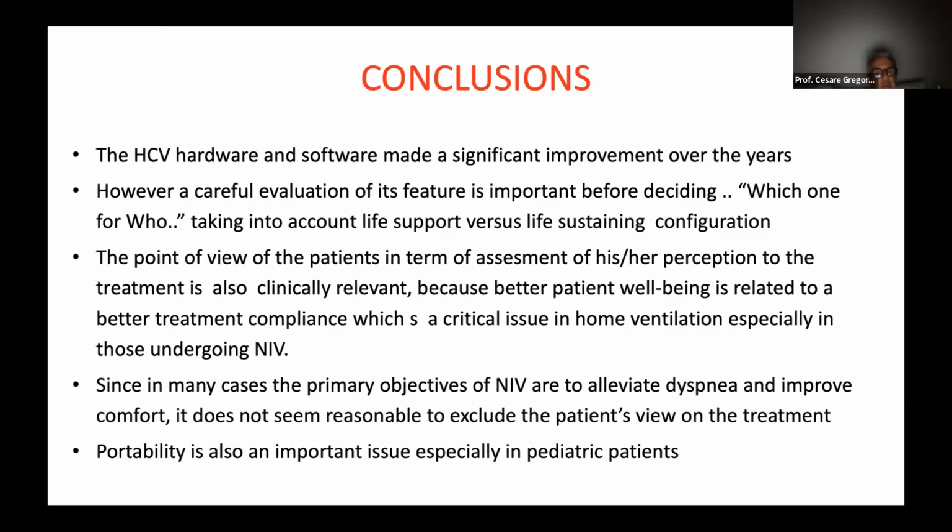I think it's very important, also in the pediatric population. And portability is also an important issue, especially in pediatric patients.